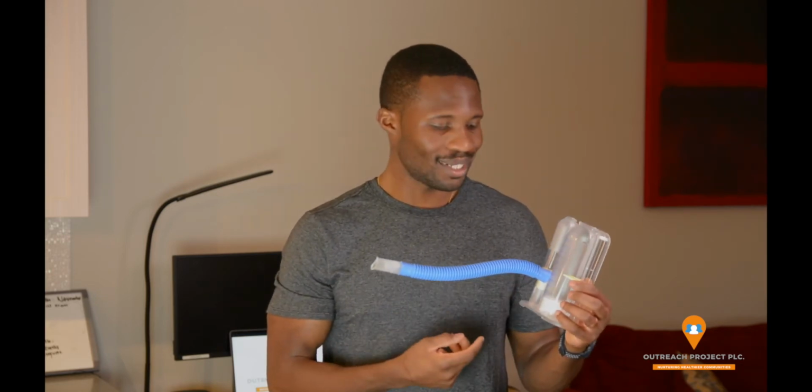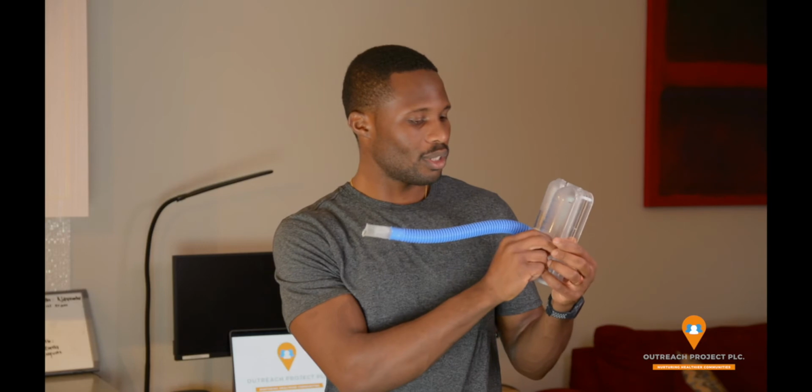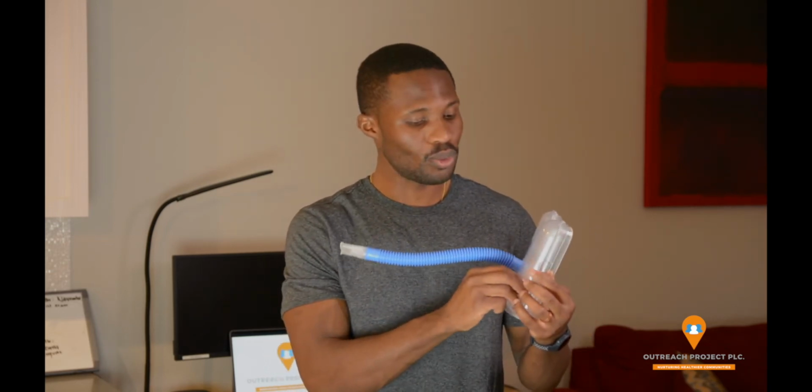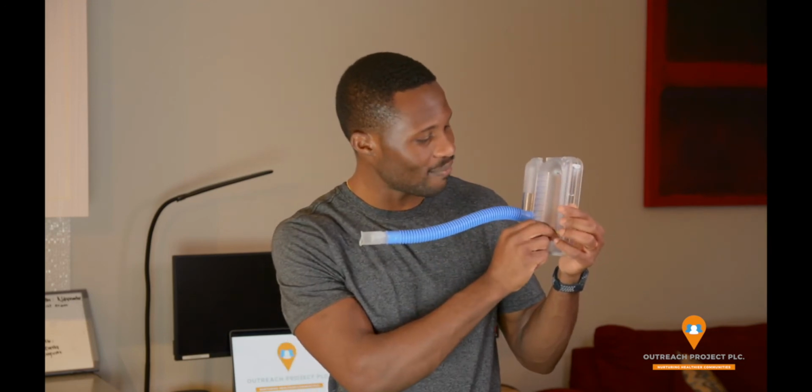When you're doing the incentive spirometer, for the very first time I see the patient, I usually have them demonstrate what they know. Based on that, we'll make adjustments. If they do it correctly, it makes my job easier, and we don't have a lot more to correct. But if they, for instance, go up to, let's say, 500, so that would look like that, they go up only to 500.